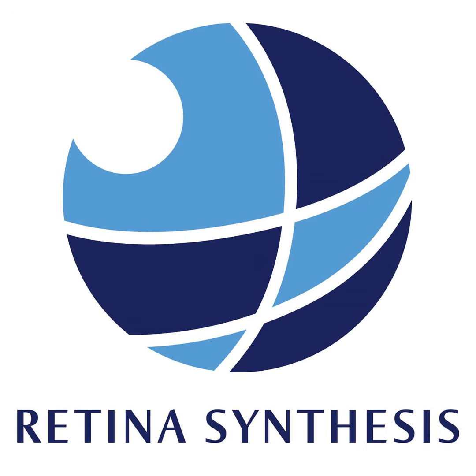I had a wonderful fellow named Jeremy Liu last year who took our entire population of drusen cases that we've been following for years, and he was able to document their progression, measure the earliest onset of these hypertransmission defects, and watch them grow. And one of the remarkable findings is how geographic atrophy grows. The stereotypical thought of geographic atrophy growing is that it forms an area of atrophy and that area enlarges, but that's not how atrophy grows. The way atrophy grows is you get these individual foci of hypertransmission defects, and geographic atrophy grows by those individual foci enlarging, and then new foci appear.